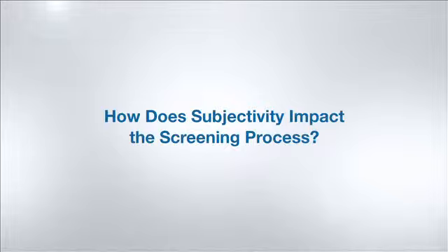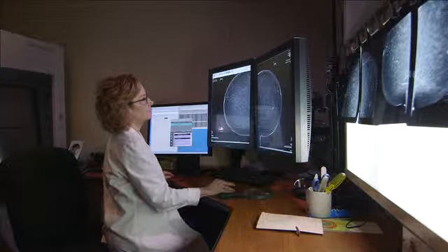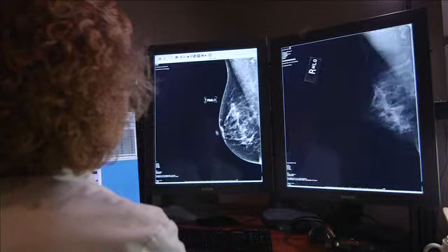Breast tissue density has always been a very subjective measurement. Radiologists will look at the mammogram and decide how dense that mammogram appears to them just by their own subjective measurement. If we are going to decide that a woman needs additional imaging based on her breast tissue density, it would be far more helpful if we could have an objective measurement that allowed us to be consistent from time to time, mammogram to mammogram, radiologist to radiologist, to decide that that specific woman needs another test or not.